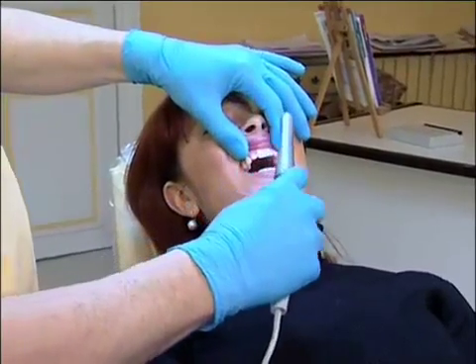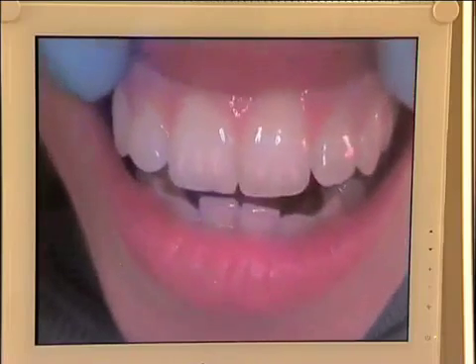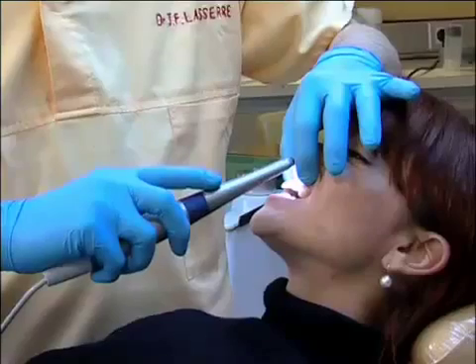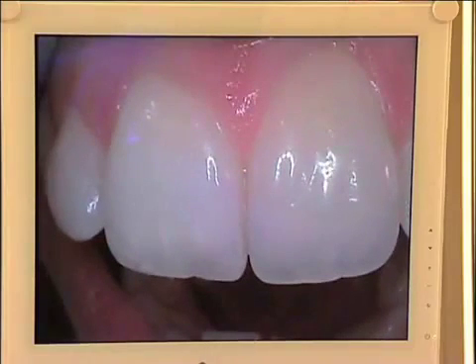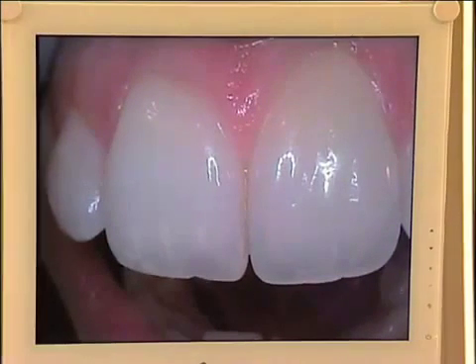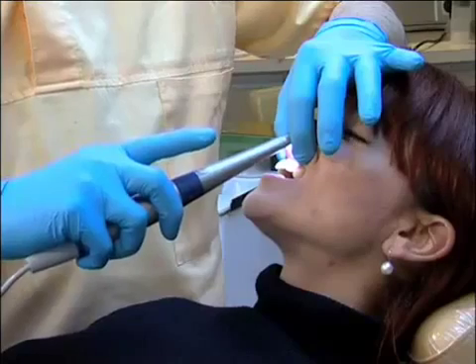A global view in the macro photography of the tooth provides the prosthesis lab with all required indications on the cervical gradation, surface aspects, characterizations and incisive edge transparency.